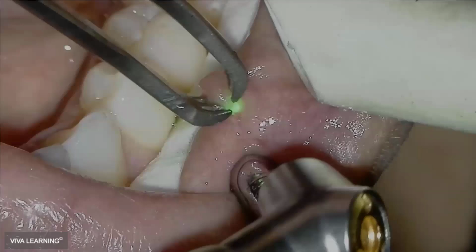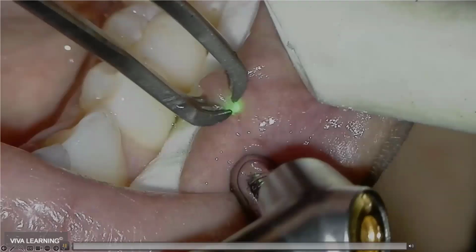So why doesn't it hurt that much, unlike surgery? Well, if I'm cutting through a big one, and I'll show you a vestibuloplasty in just a minute, it is a deep cut. It would hurt, right? Again, comfortable anesthesia-free is more for restorative teeth procedures, but for surgical procedures, I will do an infiltration. We try to do topical. In this case, I just used a little compounded topical lidocaine, tetracaine, phenylephrine. Push that gel in there, partially because I need to put a little tension on that fibroma. So I'm going to pull on it. And here I'll start playing it just for time.